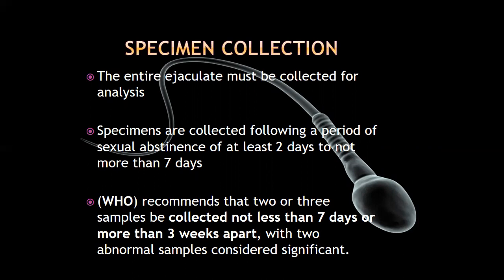No sexual contact with anyone, no masturbation, for at least 2 days to no longer than 7 days. Why? If you collect the specimen after less than 2 days of sexual abstinence, most likely you will get an inadequate sample.